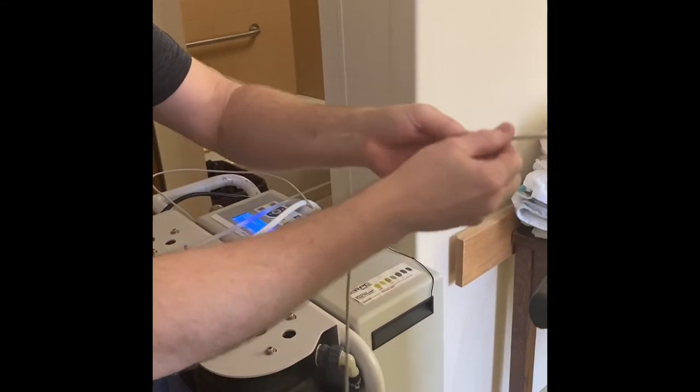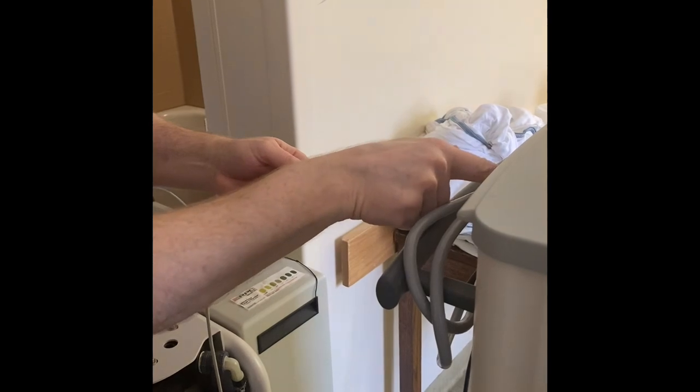Be very careful not to pull on this cord on the back of the dialysis machine.